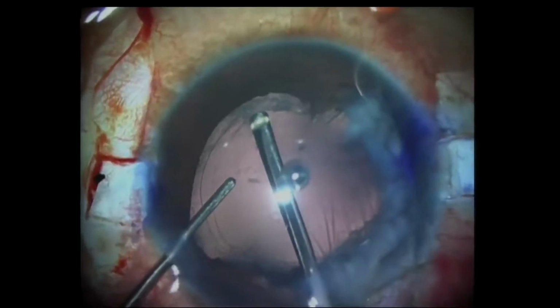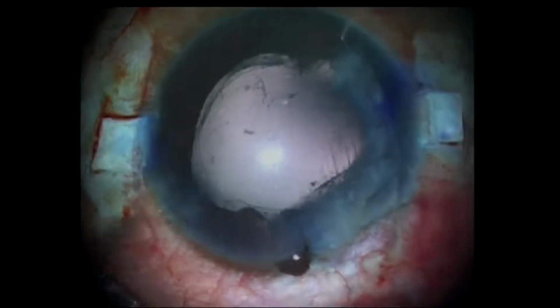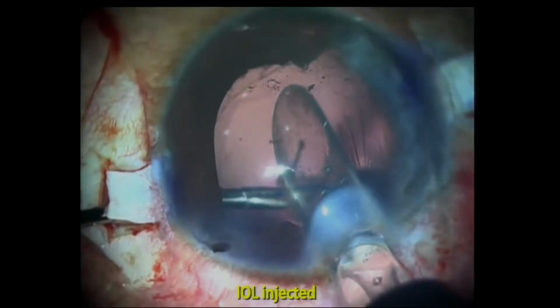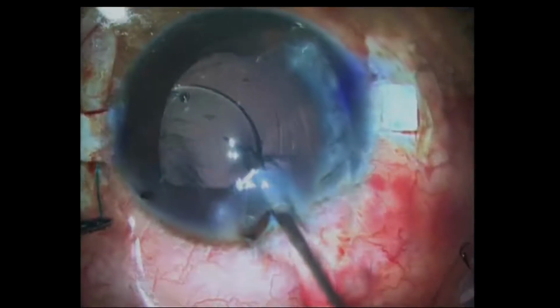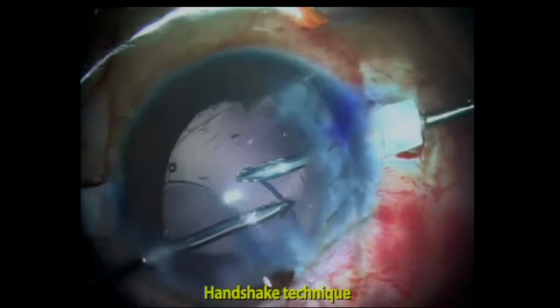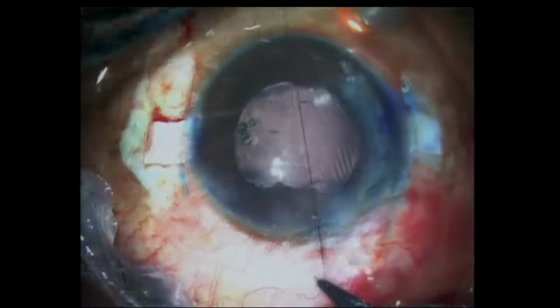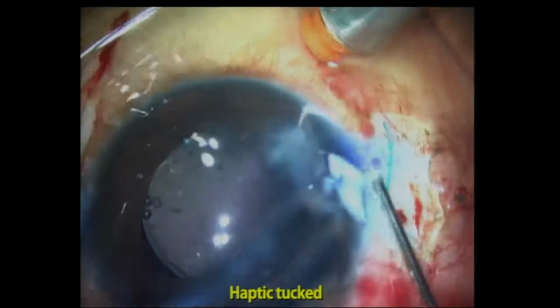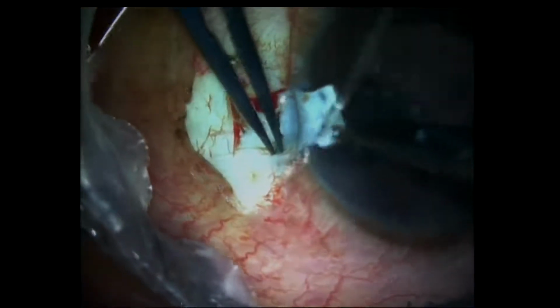Also, see the bag. It's not a clean bag. It's not going to have the visual potential that I would want in a patient like this. So I always try and do a posterior assessment just to ensure that no pieces fell down, and unfortunately nothing fell down. Try as much as possible to keep the capsular margin rim over here, and I'll tell you that later. But after you've externalized the haptics, you tuck these two haptics inside to stabilize the bag.